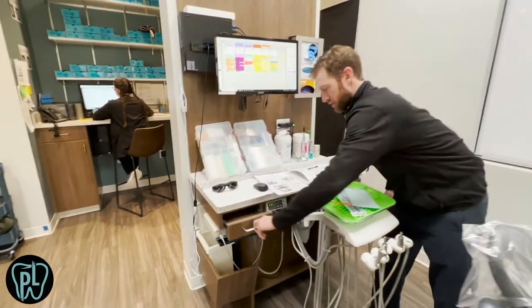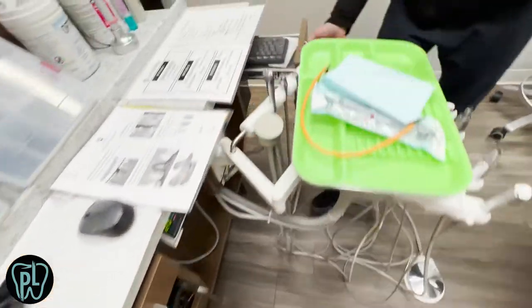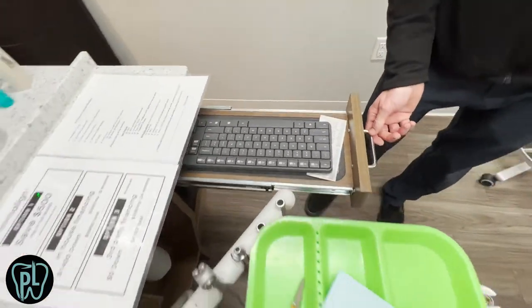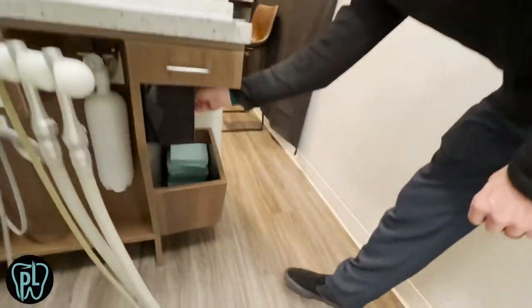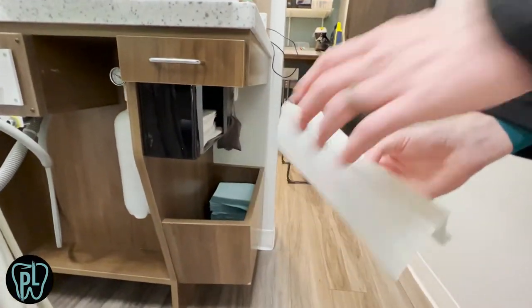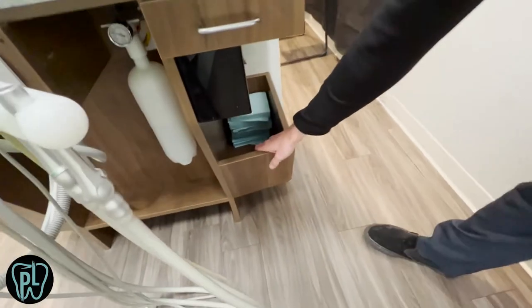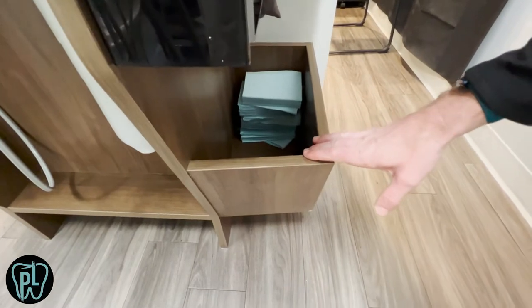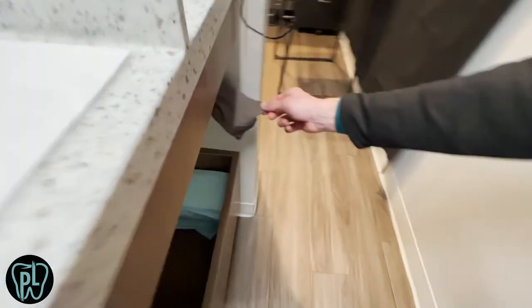These drawers are nice. That's where the remotes live right now. On this side, that's where the keyboard lives — it keeps everything out of the way. On this side, we put in a paper towel holder. Down here in these little areas, it's a storage area. We also hang the blood pressure cuff down here, so everything is super efficient.